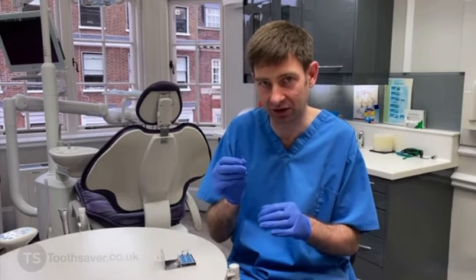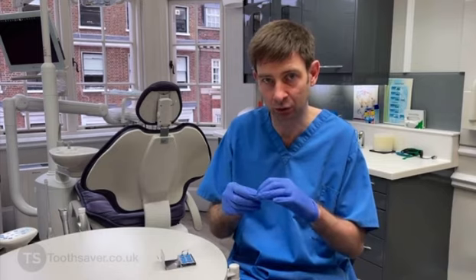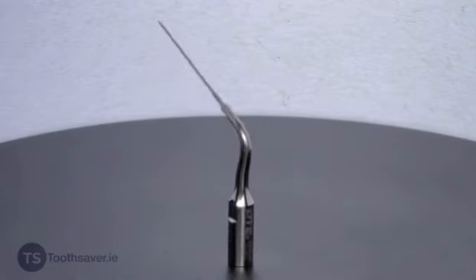The smallest one we have is a 20 tip and it's got a 1% taper. That can be really useful for removing fractured instruments as well, or really accurately removing dentine in very precise treatments.